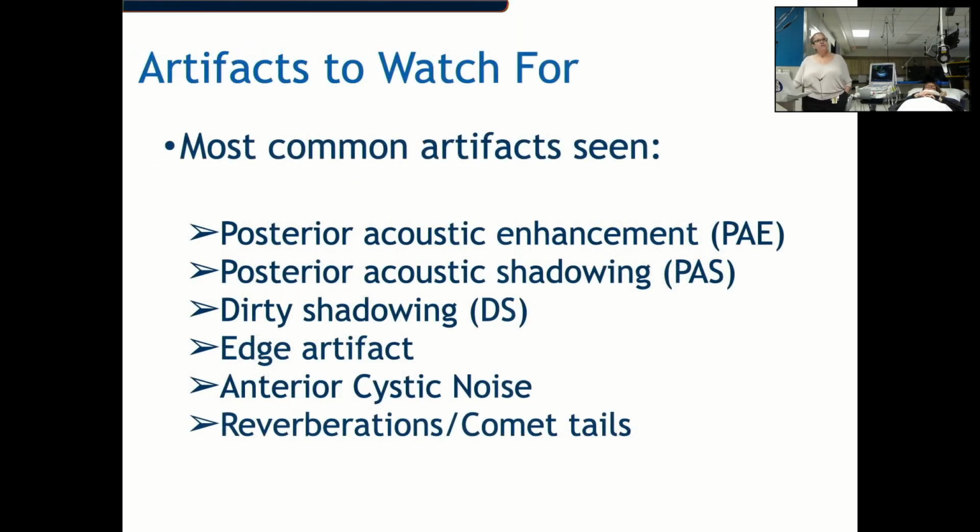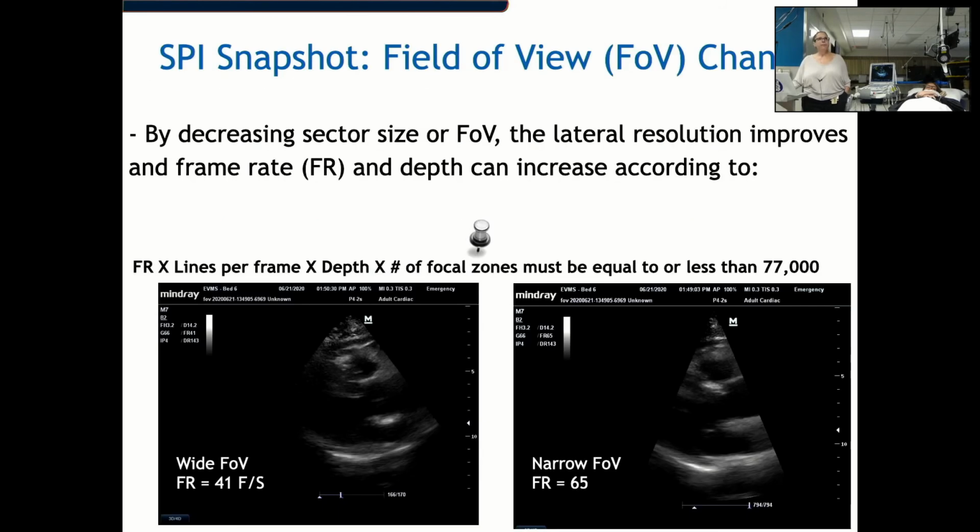Now the artifacts that we'll encounter in this view are fairly standard. So I should probably add that refraction artifact I showed you. That is very unusual. I actually myself had to think about it for a few minutes before I chose that artifact. So I don't expect that that would be the one that you pick.